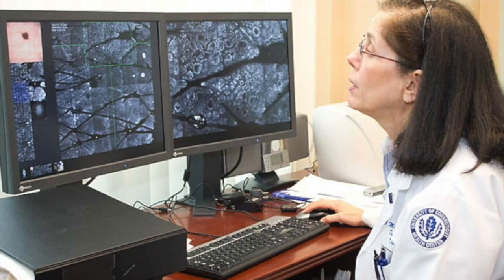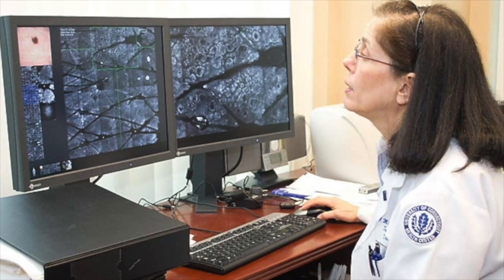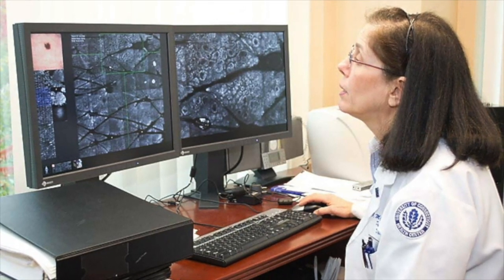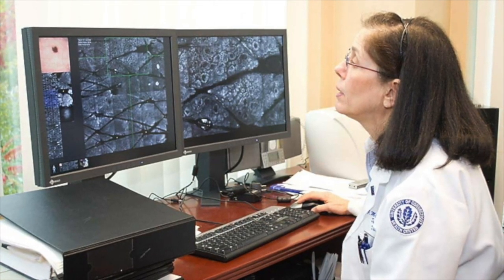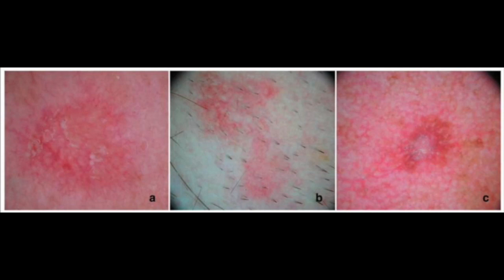Non-invasive diagnostic techniques, such as the Reflectance confocal microscope, have been developed. The Reflectance confocal microscope can provide additional information that is more advanced than clinical inspection, can preserve the tissue, and provide real-time diagnostics. It has the proper resolution that is necessary for seeing details for histological analysis and could be an alternative for physical dissection of the skin. A case study was done to see if the Reflectance confocal microscope can be a tool of interest to look at possible patients that could have actinic keratosis.